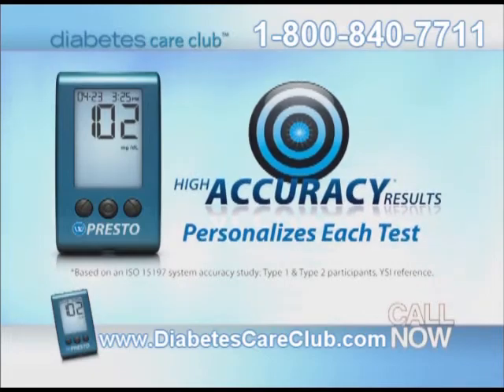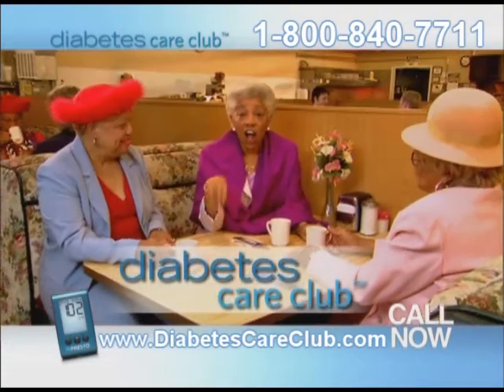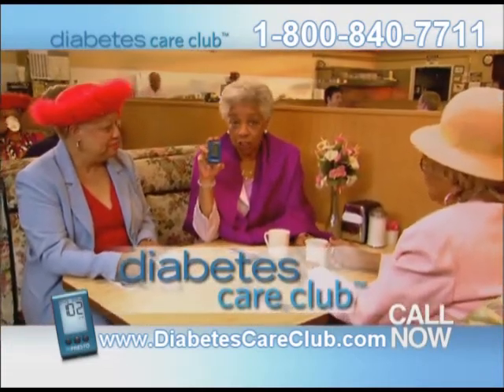No-coding helps make testing faster and confirms accuracy. And the best news is that Diabetes Care Club will send you one of these new meters. I called, got my no-code meter, now my fingers don't hurt anymore. Diabetes Care Club delivers the latest technology directly to your door for free.